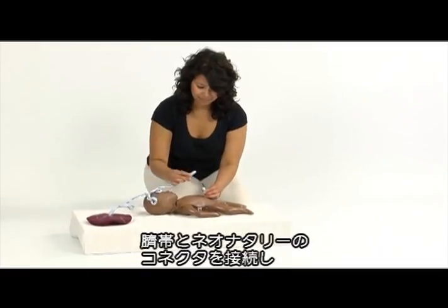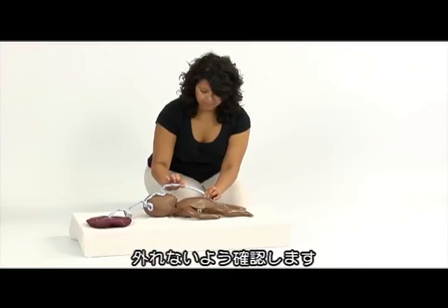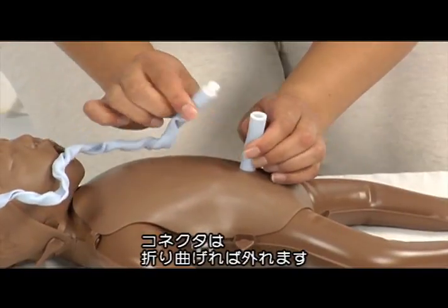Connect the umbilical cord from the placenta to Neo Natalie by clicking the two connectors together. Check that it is well fastened. To detach the cord, break the connection point with your thumbs.